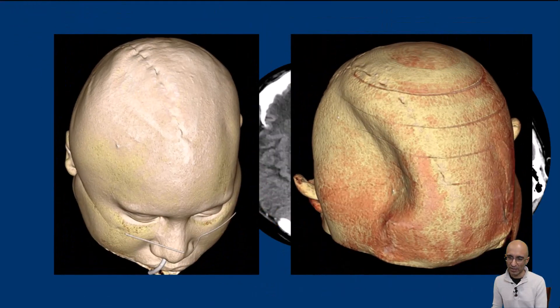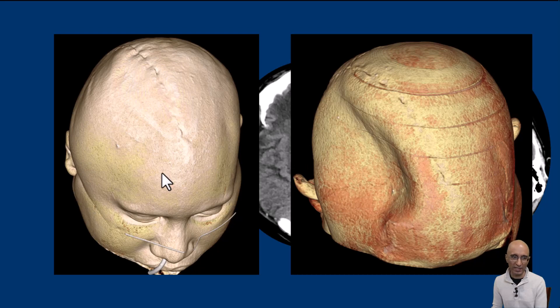As you can clearly see on the 3D reformatted images, the skin flap is sunken. Compare that to the immediate post-surgical CT head examination.